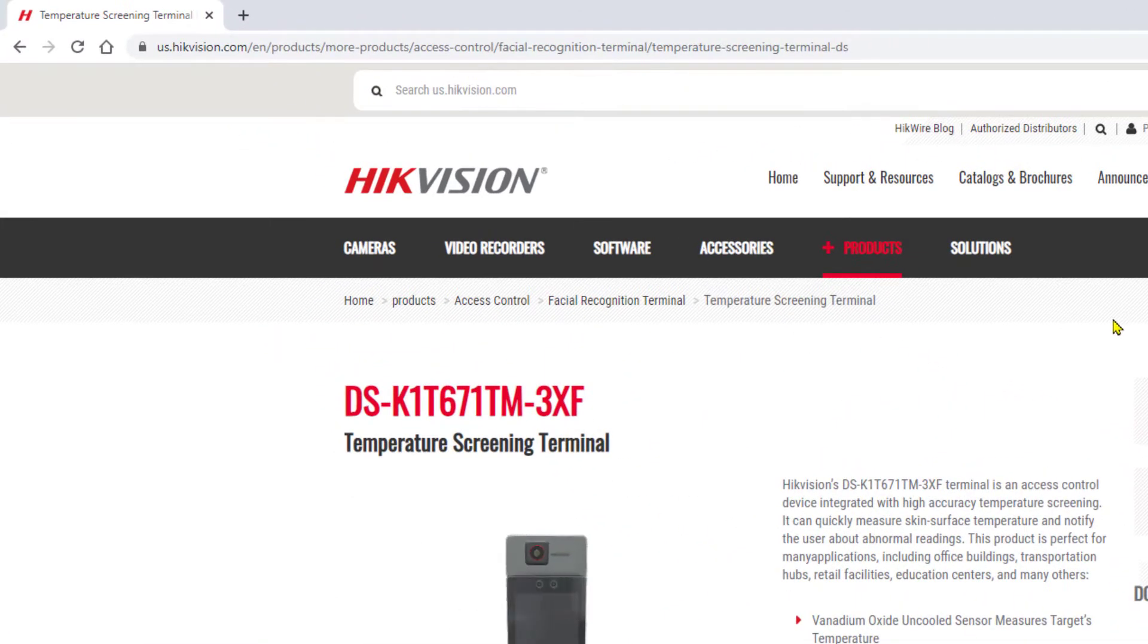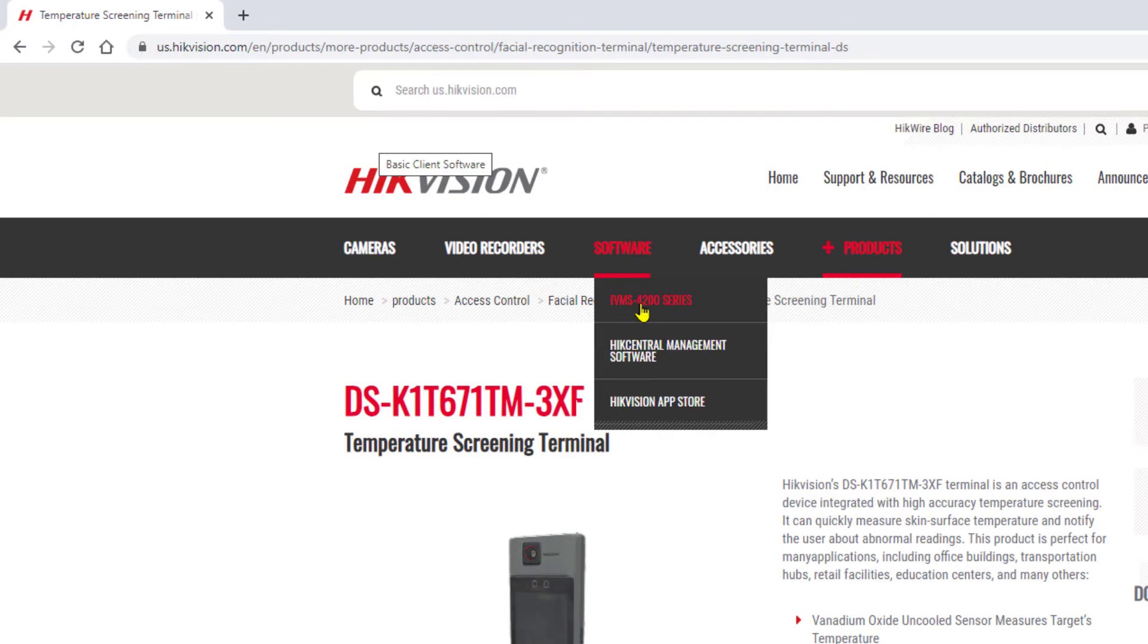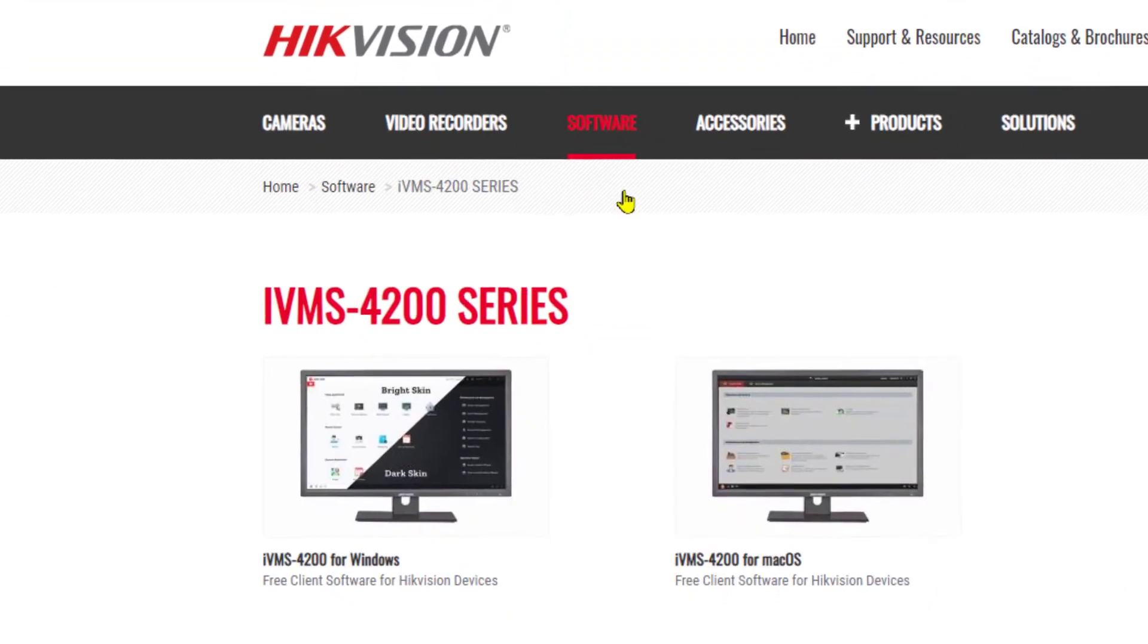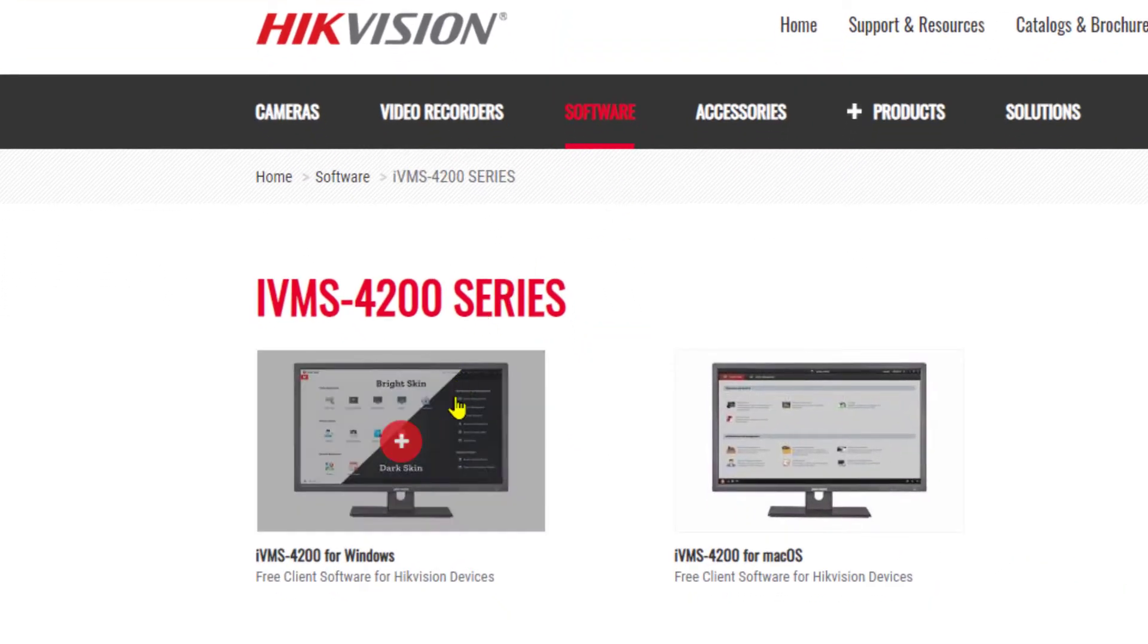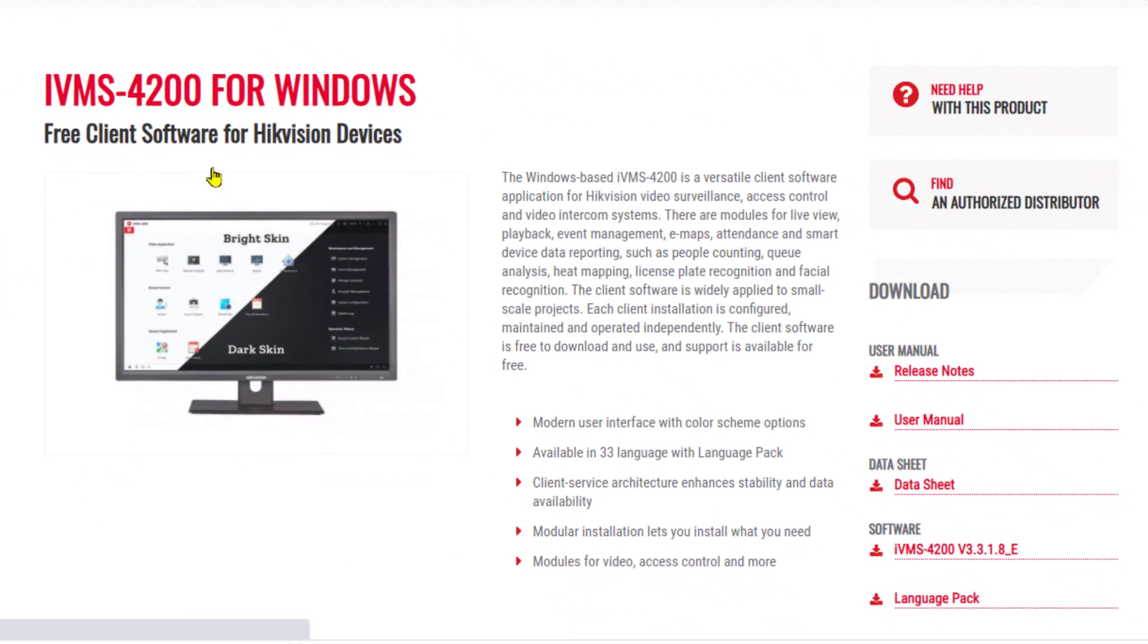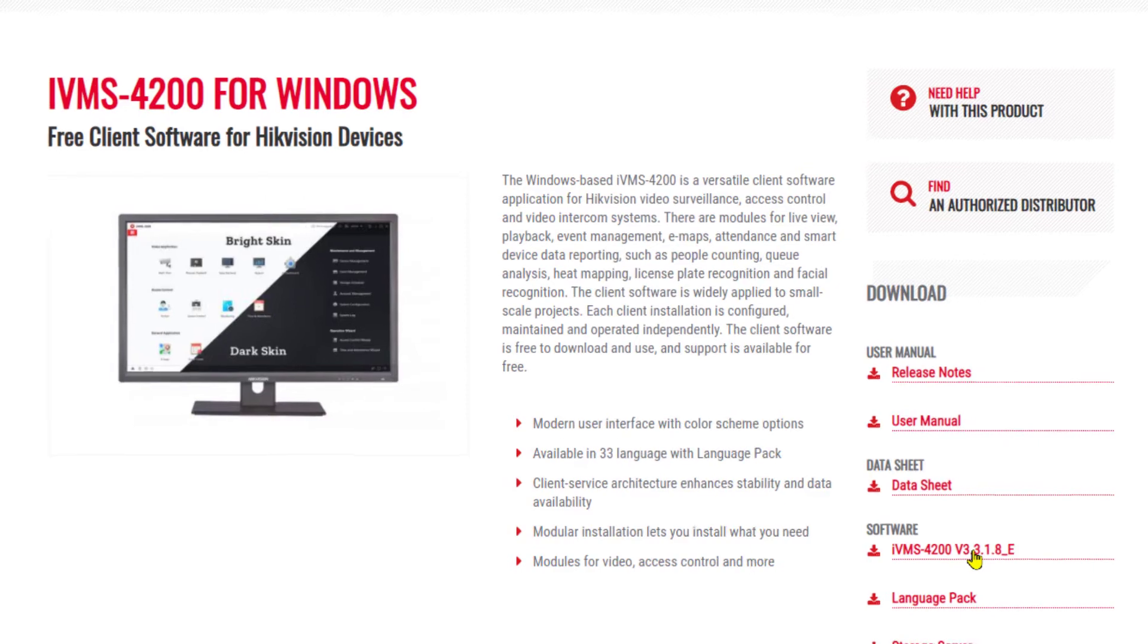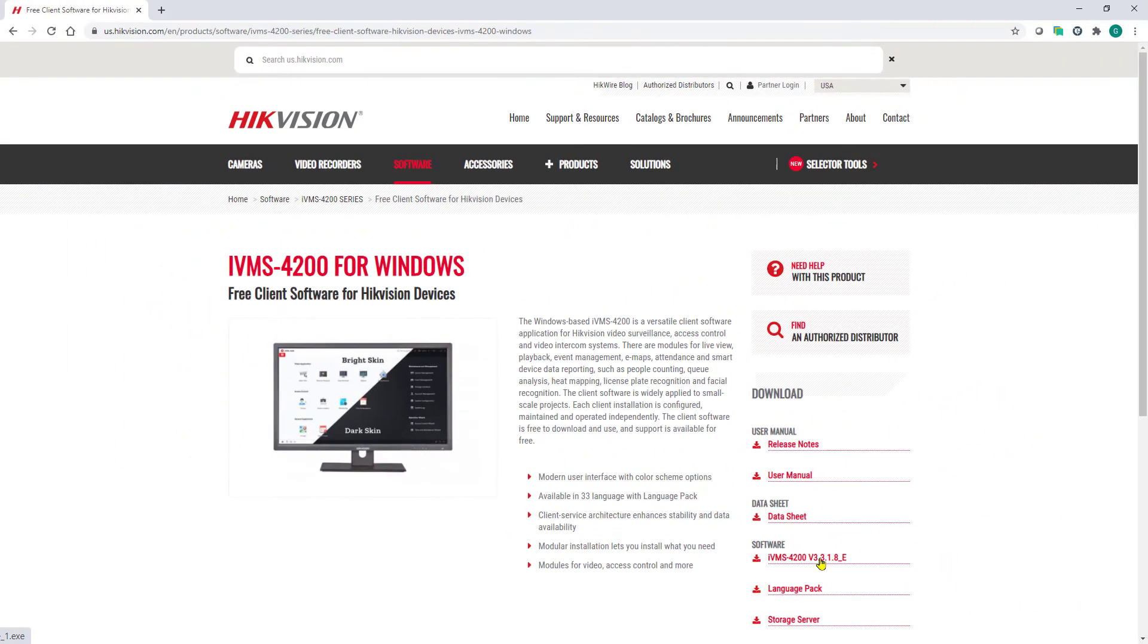So to get that, we're going to go to software, IVMS 4200 series. In this case, since I have a Windows PC, I'm going to do IVMS 4200 for Windows, and I'm going to go ahead and choose to download the software, this being the latest available version.